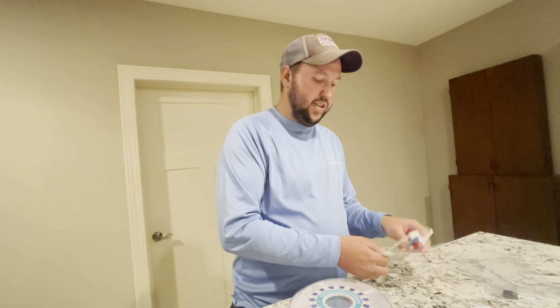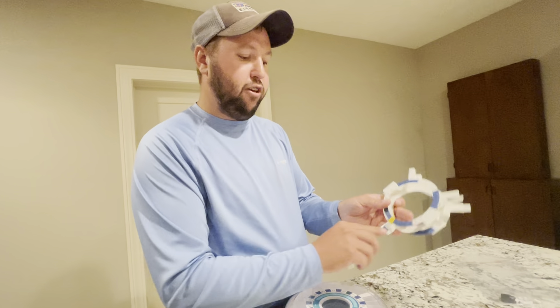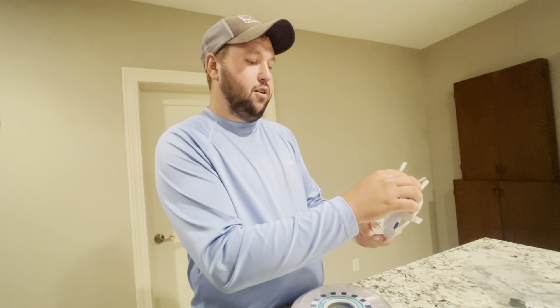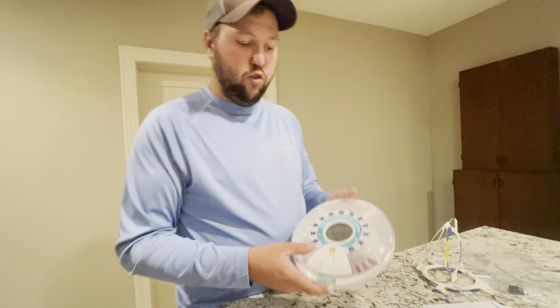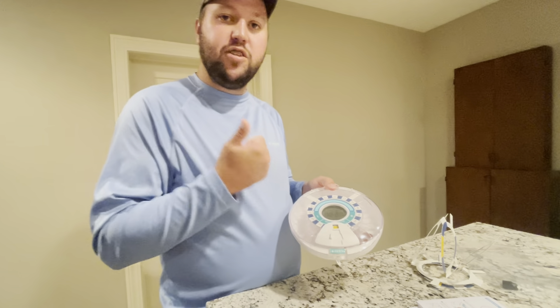It comes with these little organizers as well. It will remind you up to four times a day — one, two, three, four — and it goes all the way up to six. So one to six reminders. Definitely a great product for someone that needs a reminder on taking pills, so definitely try it out.